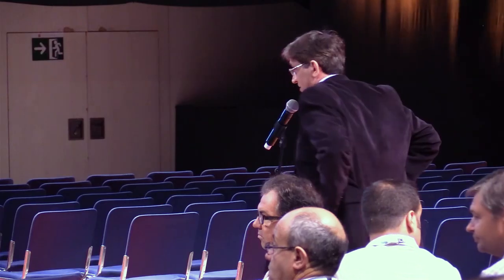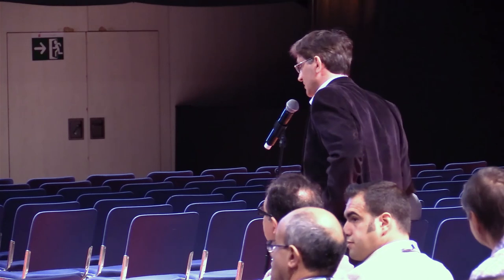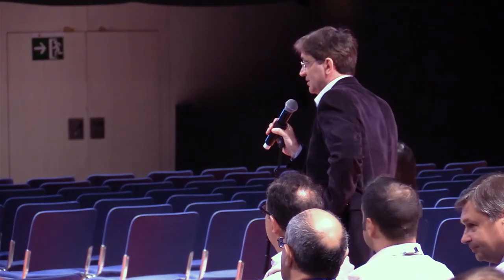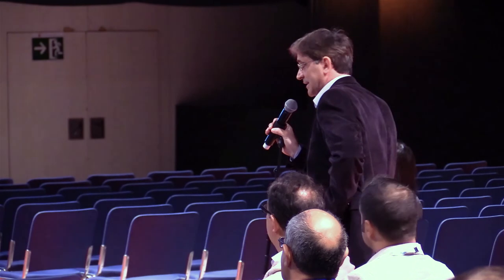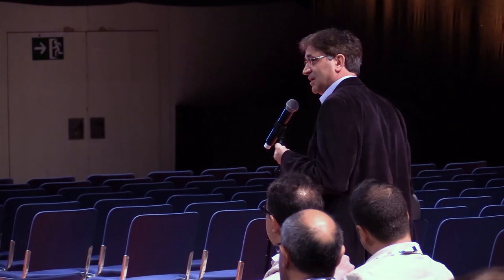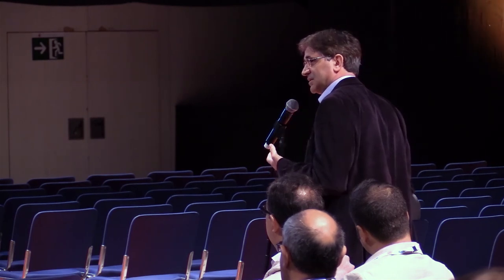If we have time, I have a comment and maybe a question for Dr. Zornich on pneumatic retinopexy. I have a comment on puncturing the cornea with the needle. I don't do it that way. I do it with the MVR blade because it's much better, and that wound usually seals, and you can regulate the pressure as much as you can. My question is whether you can always inject 0.5 cc of gas, because I noticed in my patients that many times when I inject 0.3, I have immediate arterial closure. So is it possible to always inject 0.5 cc?